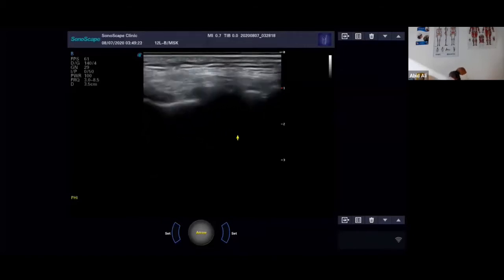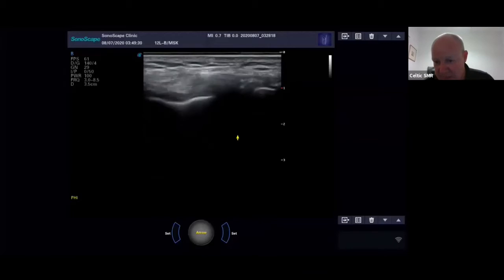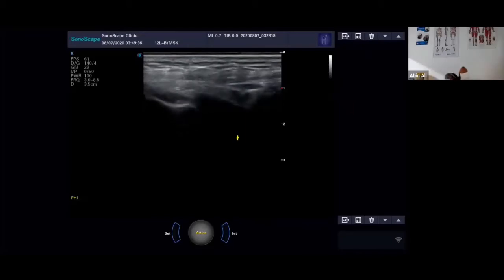Transverse popliteal. I didn't even know where to look for that. Elaine says that's very helpful, so thank you. Oh, good. On that previous question, but not on this one. You're not off. Not on this one. If you can help us out anatomically, we're not quite sure where that lives.